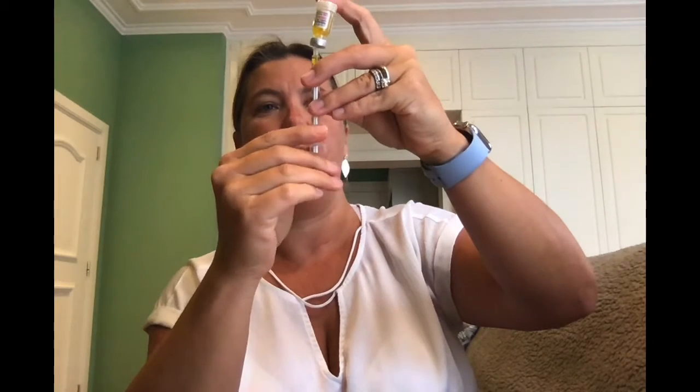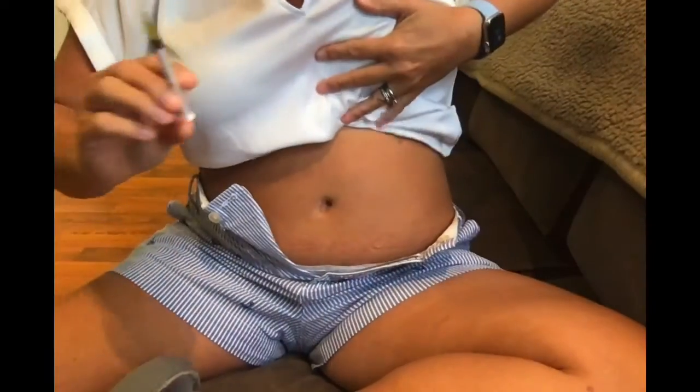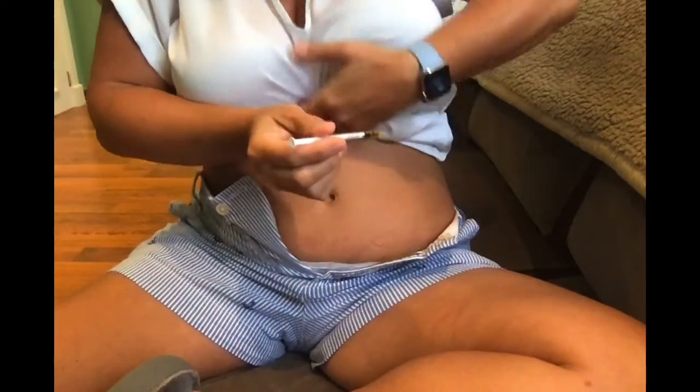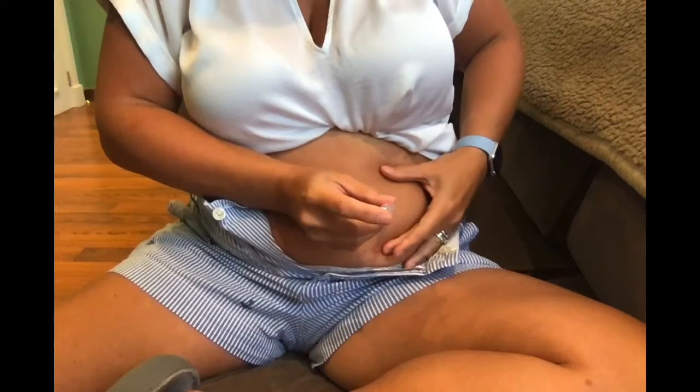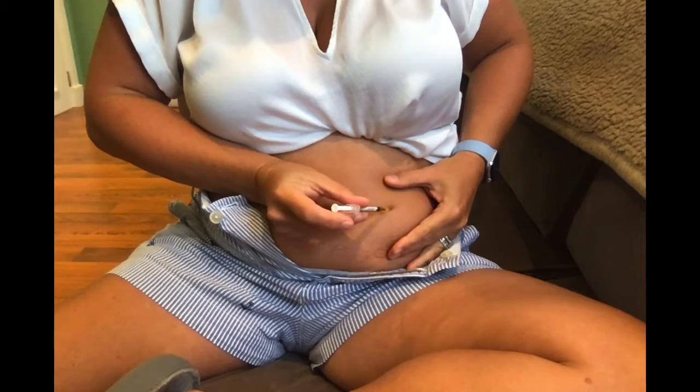Quarter of a vial. There still looks to be air in it to me. This is what you see them do at the doctors all the time, and then — oh there's no air, it's just the way it looks. All right, here we go, down to my stomach. 45 degree angle is what they said, so we go in.